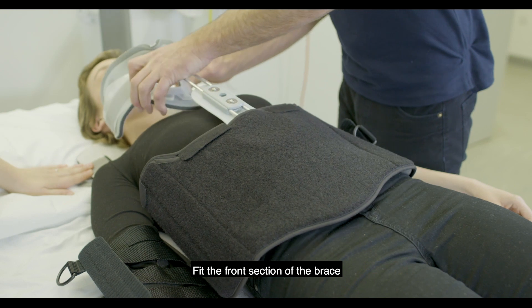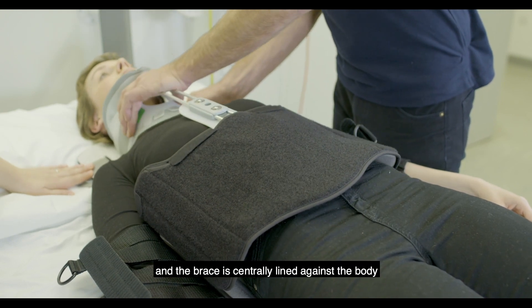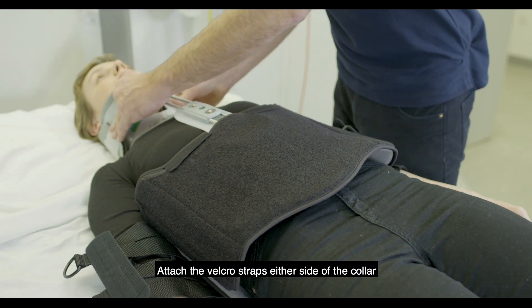Fit the front section of the brace ensuring that the collar is fitted snug around the throat and the brace is centrally aligned against the body. Attach the velcro straps either side of the collar.